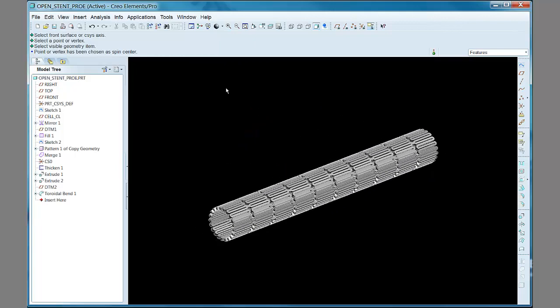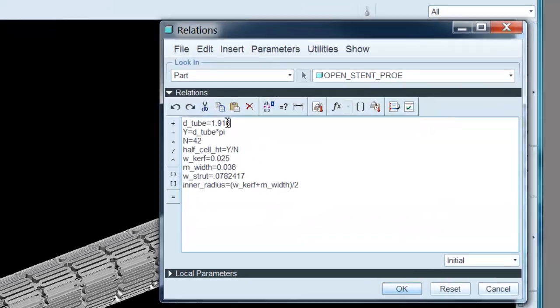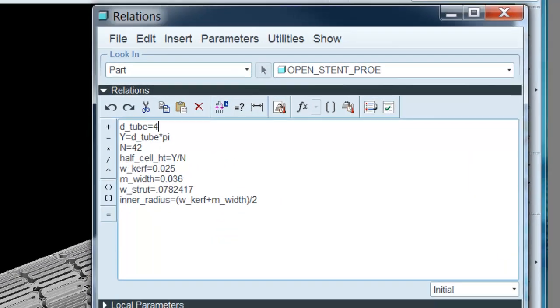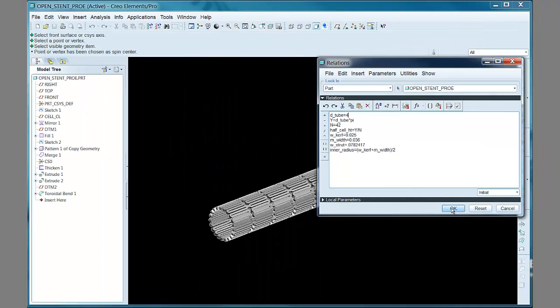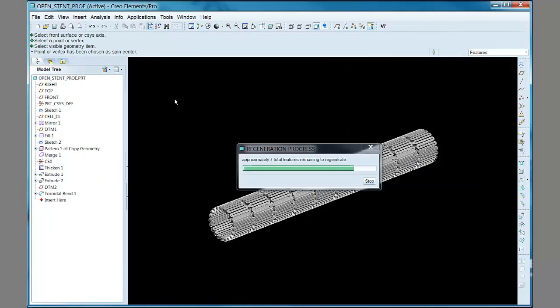Using relations, the model is set up so that the outer diameter of the stent can be parametrically varied between a minimum or crimp state of 1.916 millimeters to any number of deployed diameters up to 8 millimeters.